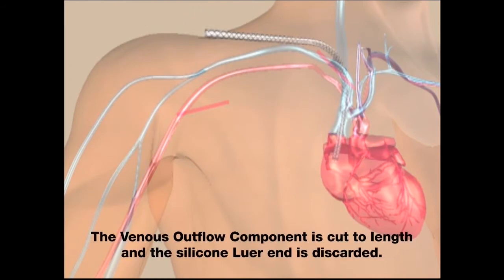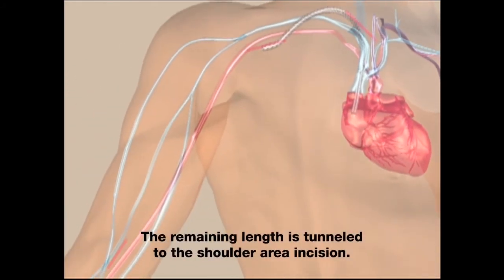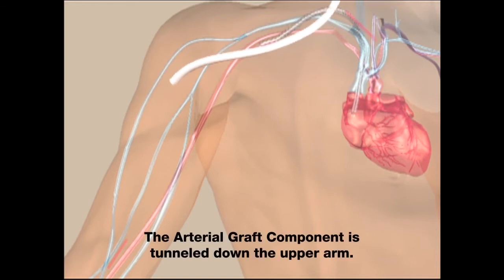The venous outflow component is cut to length and the silicone Luer end is discarded. The remaining length is tunneled to the shoulder area incision. The arterial graft component is then tunneled down the upper arm.